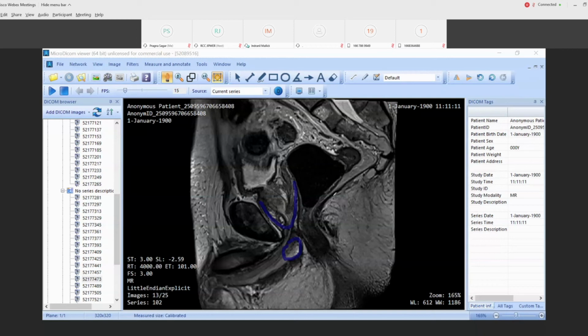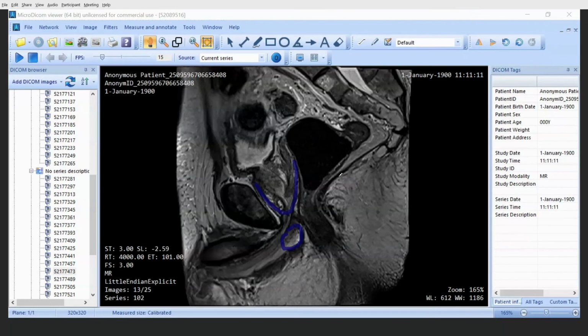Just technologists will not be able to do it. If you are happy to do daily verification by yourself, then you can reduce the PTV margin to 5mm posteriorly. There have been people who do a 3mm posterior margin, but without implanted fiducials and intrafraction tracking, I think 3mm margins are a bit unsafe.